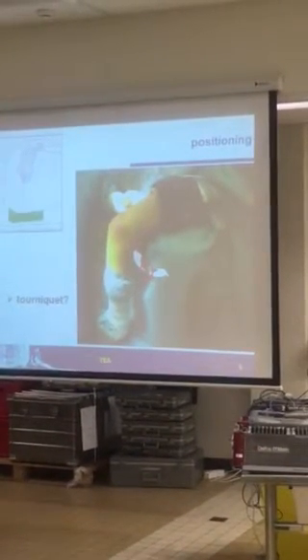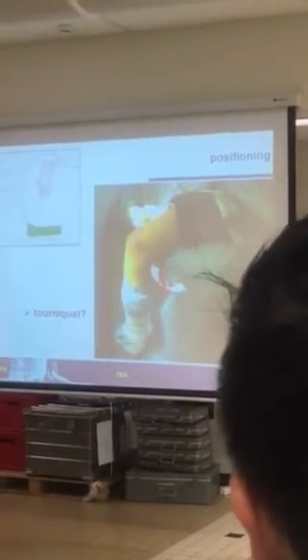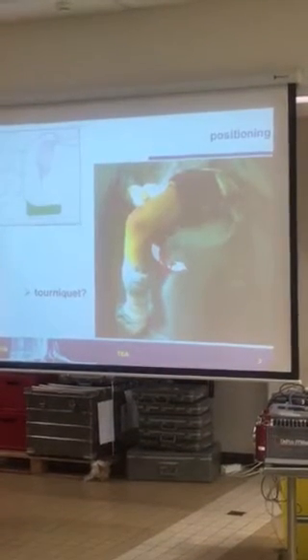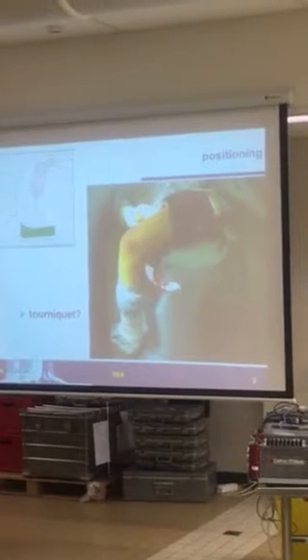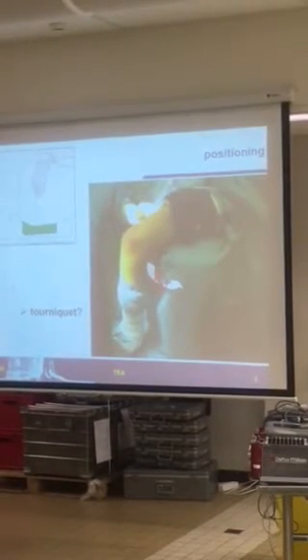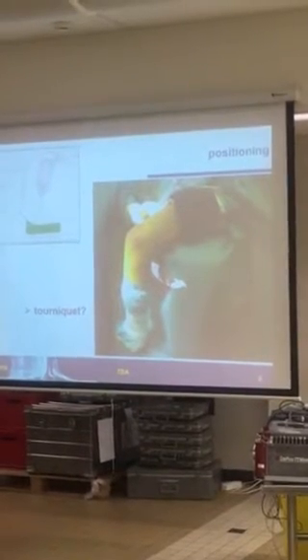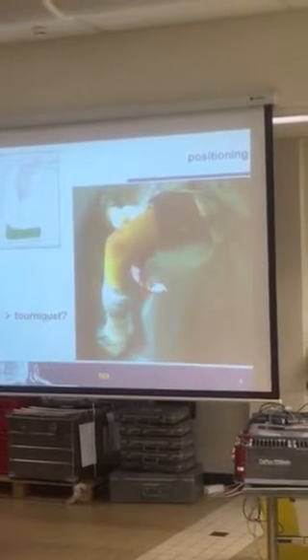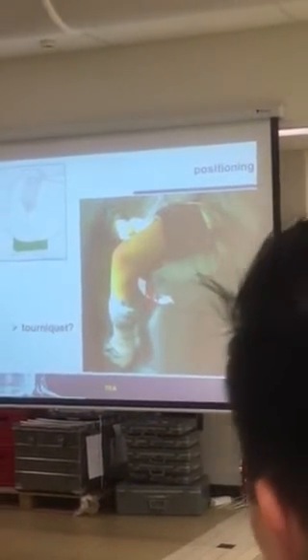You see the tourniquet, it's on the elbow. Nowadays we don't use the tourniquet anymore. We only use it if we have really problems with bleeding. But normally we just leave the tourniquet off. And maybe we just put the tourniquet on during the cementing process, and immediately afterwards we release it again. It saves a lot of pain for the patient. To be with a two-hour bloodless arm gives you a real problem.